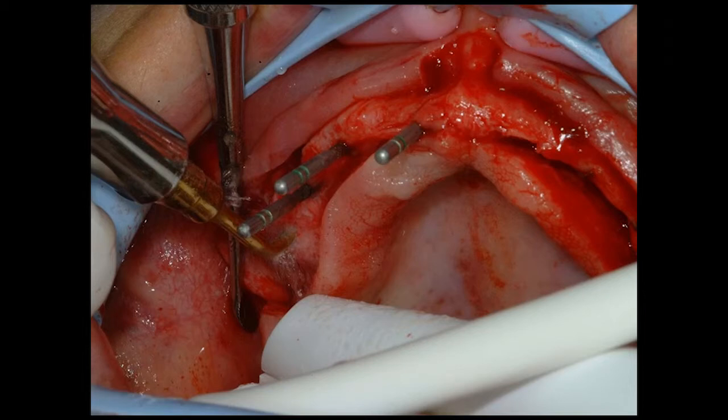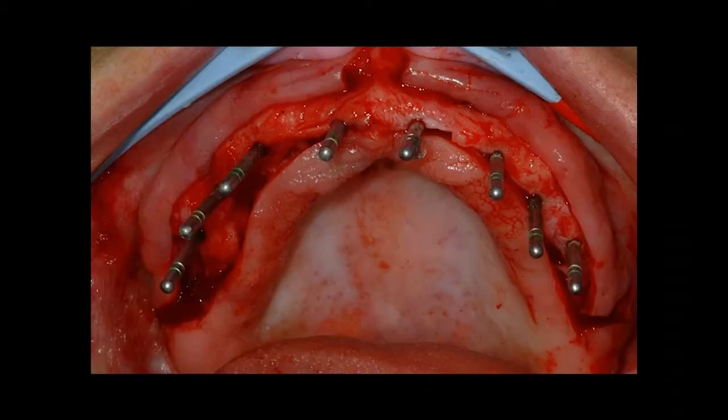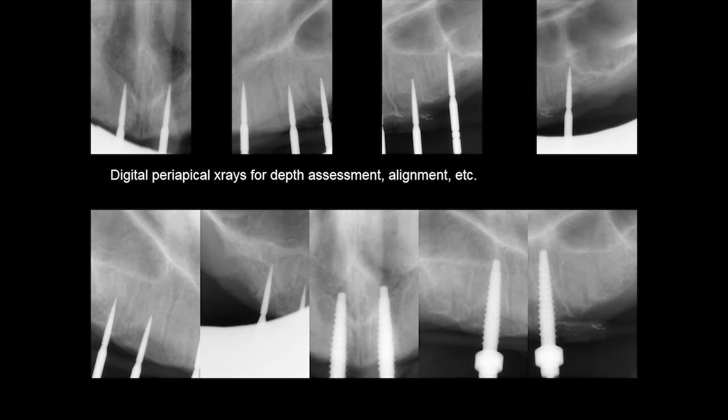And as we make each initial penetration, we're going to put a Brasseler taper diamond burr to look at our parallelism and look at our alignment. And so this came out pretty nice. It was planned on the guide so that mesiodistally we have everything where it needs to be. You know, the worst thing for a case like this, particularly with Mike, is if one of the implants is between 10 and 11 or between 9 and 10. I wanted to make sure that we got everything right where it needed to be. So here's the initial penetrations.